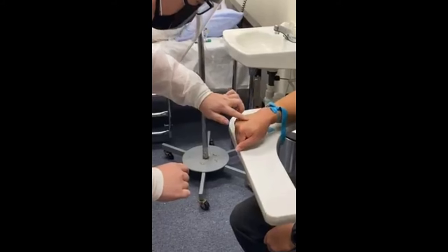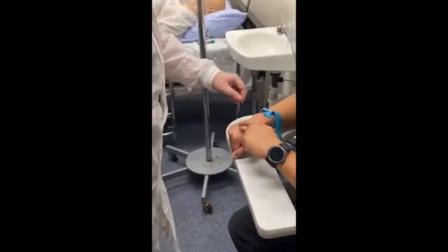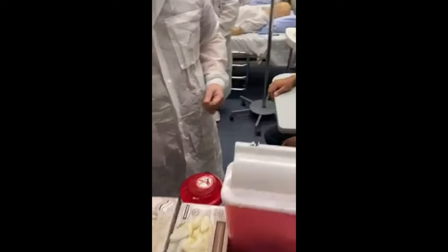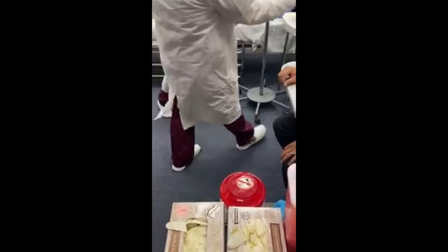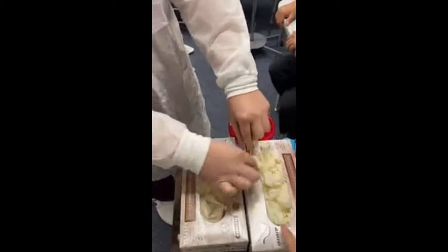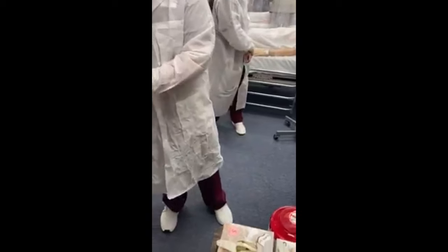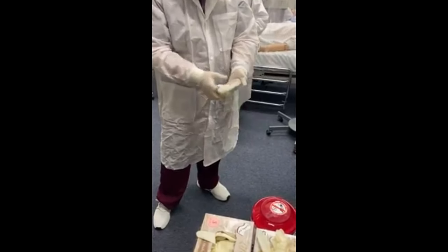Can I use this one? Yeah, either one is fine, whichever you feel comfortable using. Okay. Yeah, I'll use this. Okay, so now you found your vein. Go ahead and I can release this. Okay, perfect. Alright. So now let's just. Are you okay, sir? Yes, I'm good.